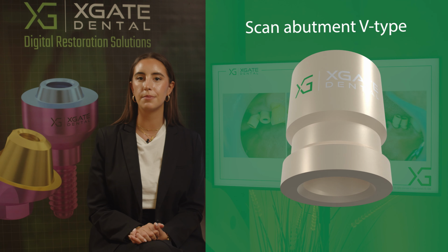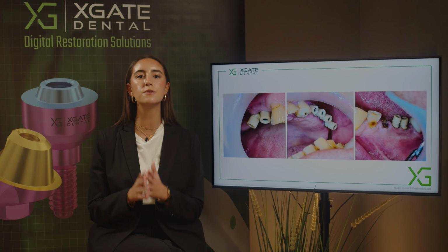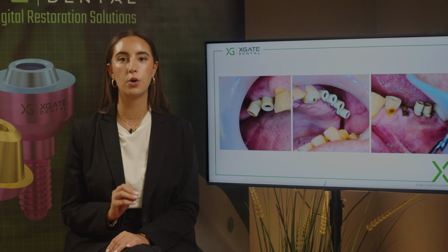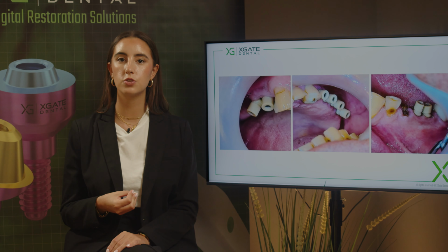These are interesting scan abutments because when you have a very close proximity to implants, you can't just fit the scan abutments. You have the same problem with transfers. Now, you can't take impressions here because the implants are very close to one another. So we want to restore both of the implants. So what we did is we took part of the scan abutment out. We just cut the scan abutment and we scanned with 1 full scan abutment, and then 1 scan abutment that we cut 1/4 of the scan abutment that we took out.